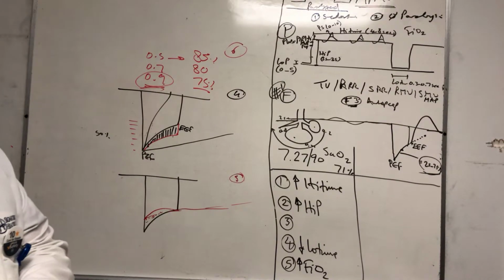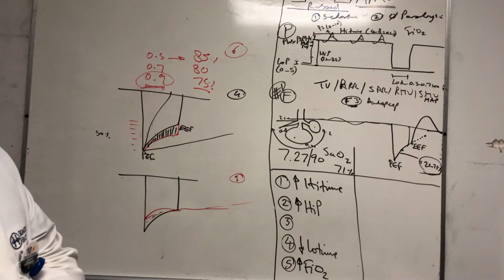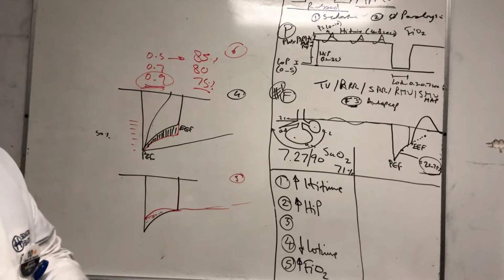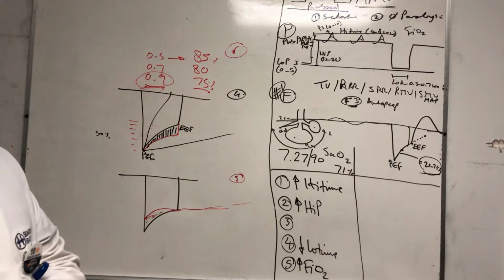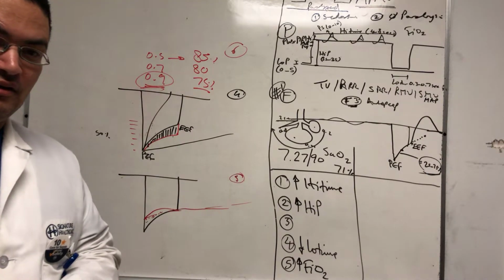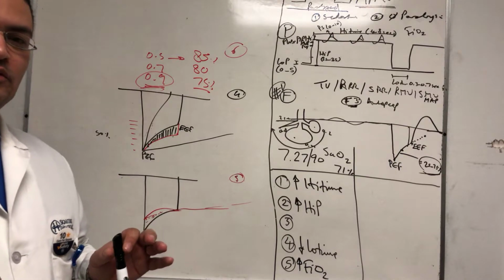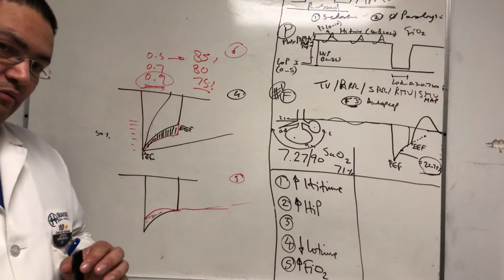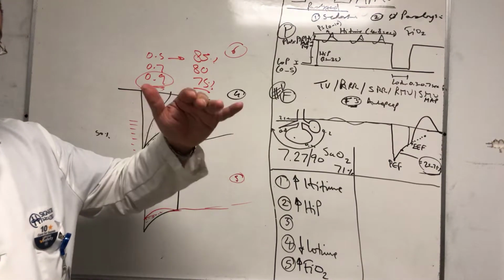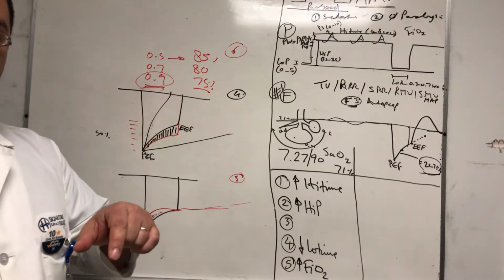It's a dumb question. Can you ever really go up on the high time without going down on the low time? Right. Oh, you can change them, they don't interact together. Okay. Some old vents actually have them attached together. That's why we may be confused about it. They have them within the same respiratory rate. So instead of having high pressure, low pressure, high time, low time, they have high pressure, low pressure, high time, respiratory rate.